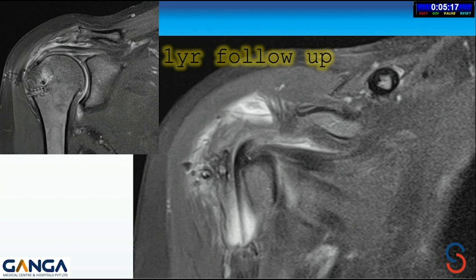It seems that the location where the tear has occurred is where the rotator cable attaches and then runs into the subscap. It always looks like it's also functionally a remnant of the cable. Do you think that by including that in your repair instead of removing it, it might also increase function at the end? What do you think?